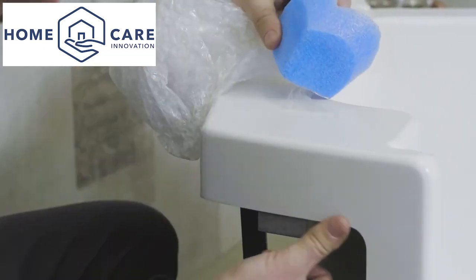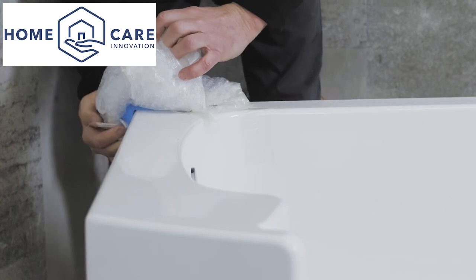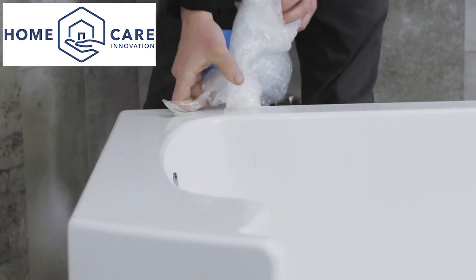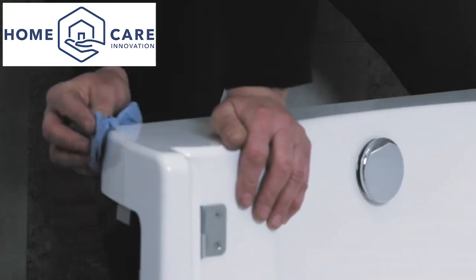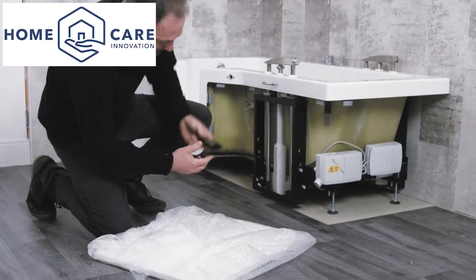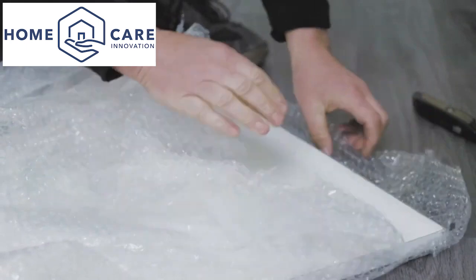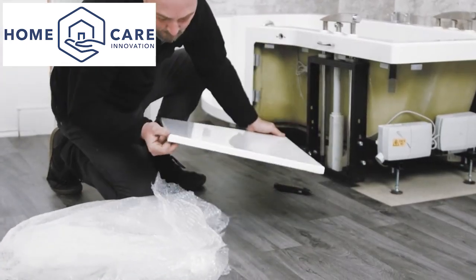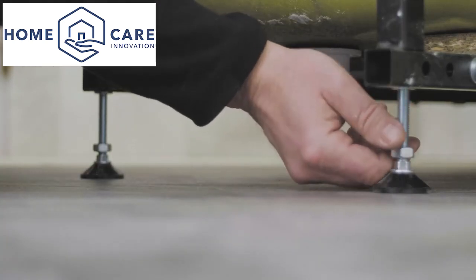Unpack your bath carefully and inspect it. Carefully look for signs of damage, especially on the outer corners and on the lower lip of the door flange. It is also important to inspect panels at this stage so that any issues can be dealt with promptly. Check your delivery against the parts list and delivery note, and check the bath legs are not bent or damaged and that the retaining nuts are in place.